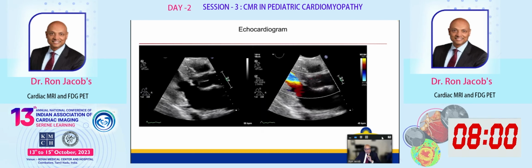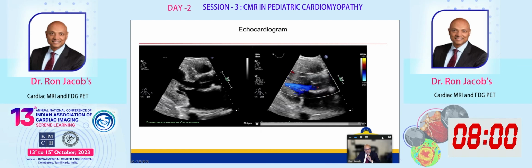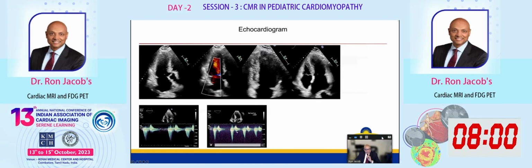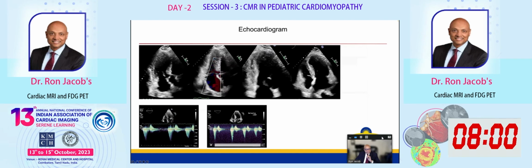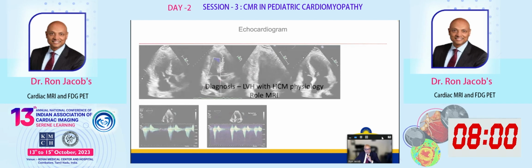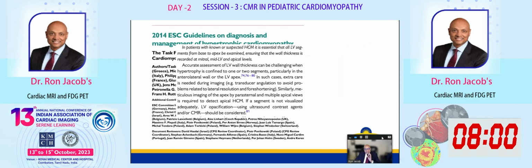And this is his echocardiogram. There's some LVH, a septal knuckle with flow acceleration in the LV outflow tract. And the echo suggested a gradient with Valsalva in the LVOT and the presumed diagnosis of hypertrophic cardiomyopathy. And this is why CMR in somebody with presumed hypertrophic cardiomyopathy, if the echo has presumably made the diagnosis.